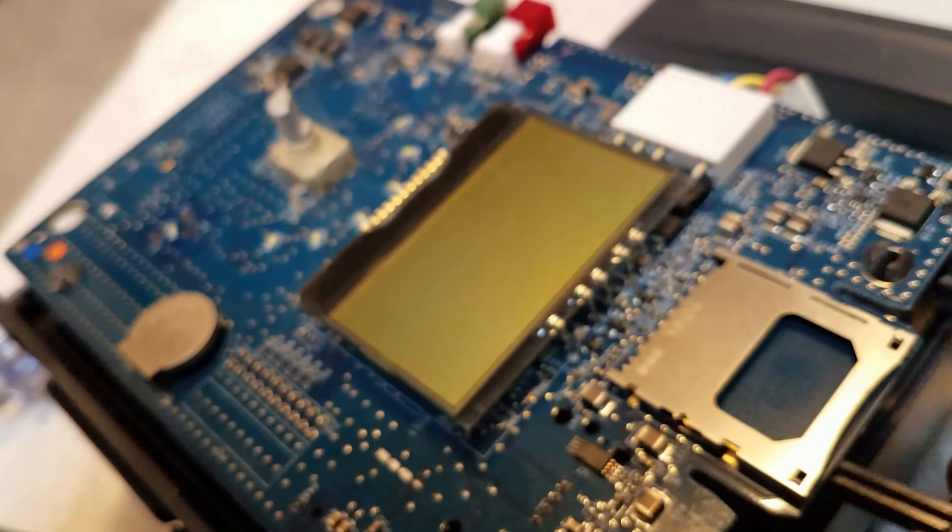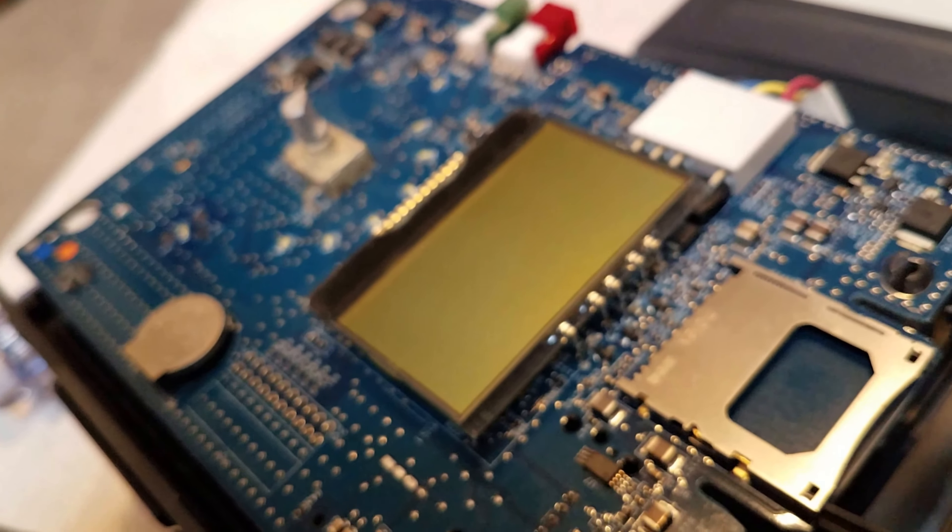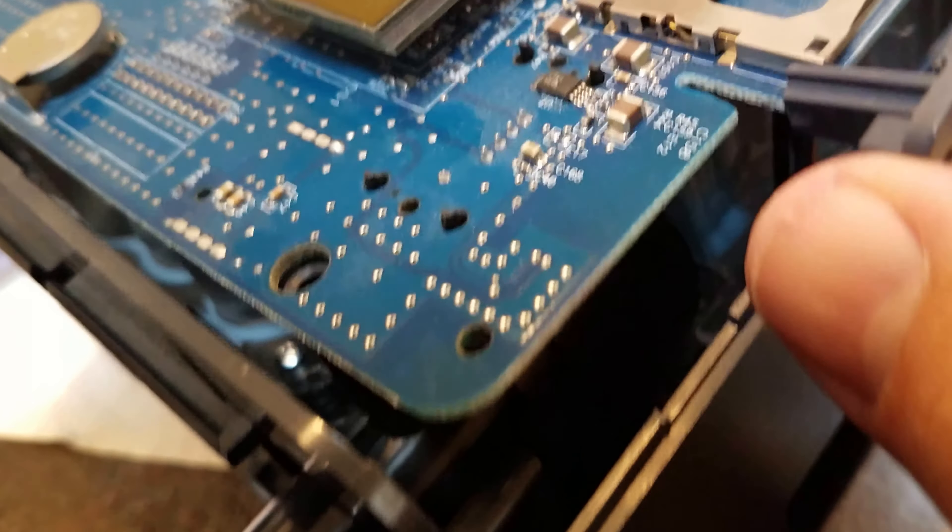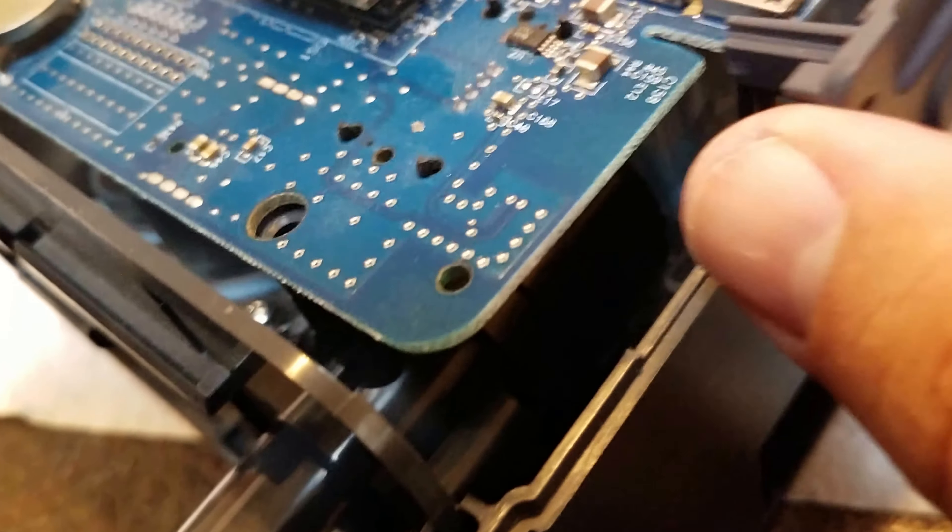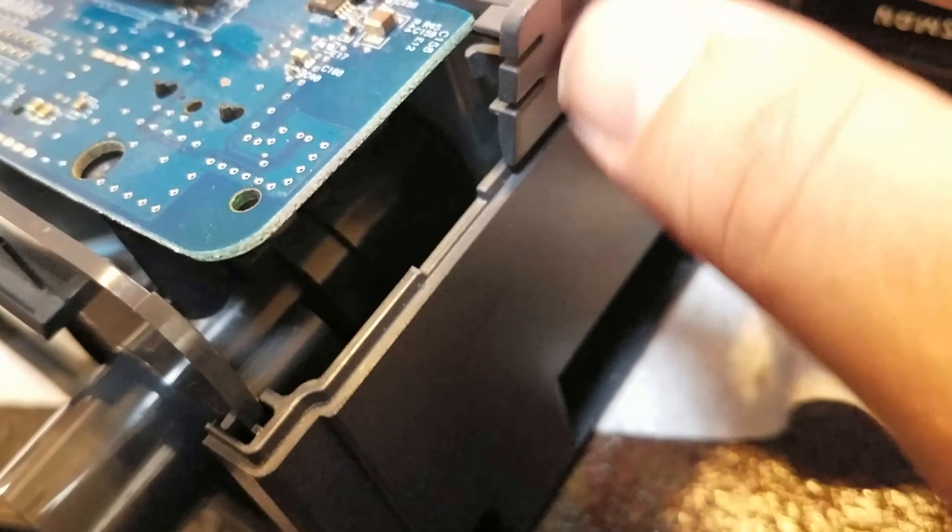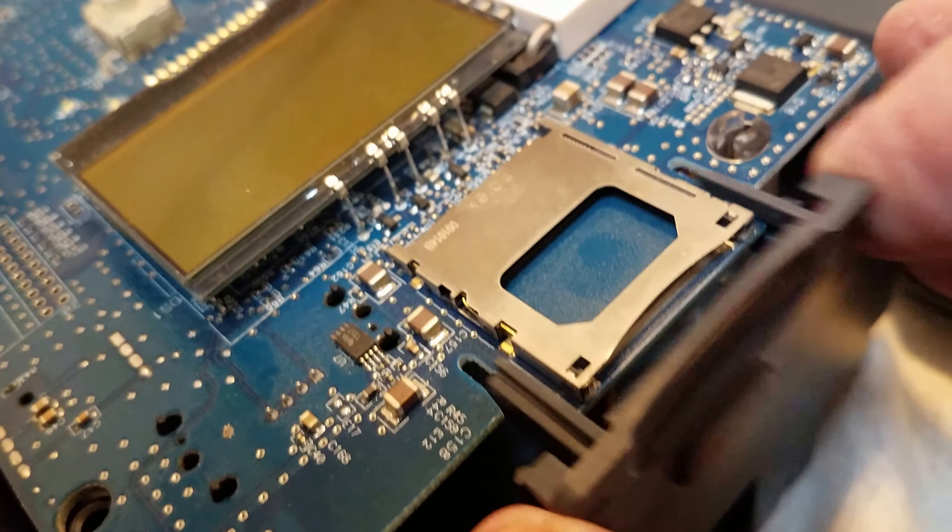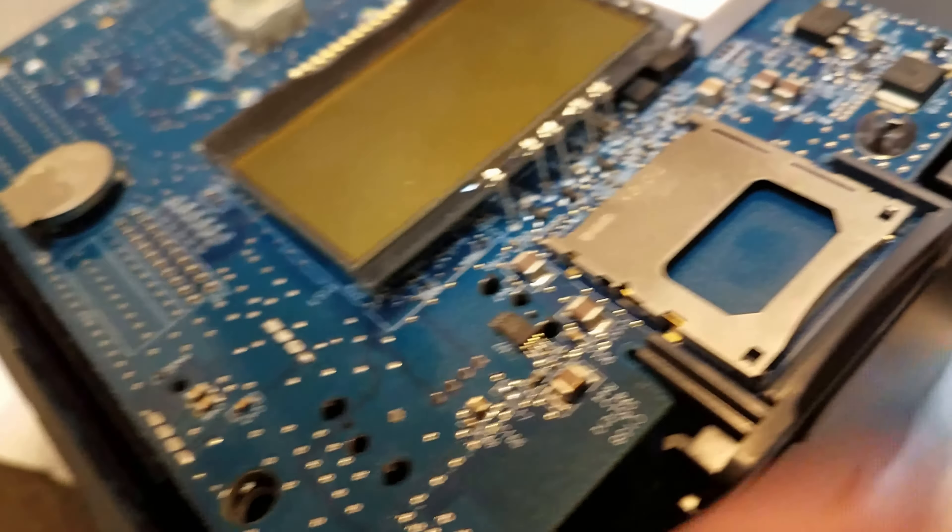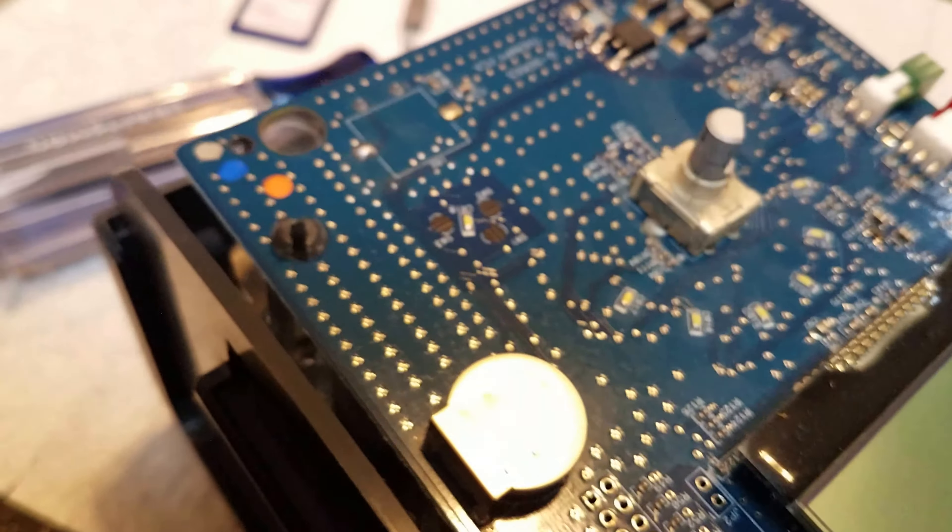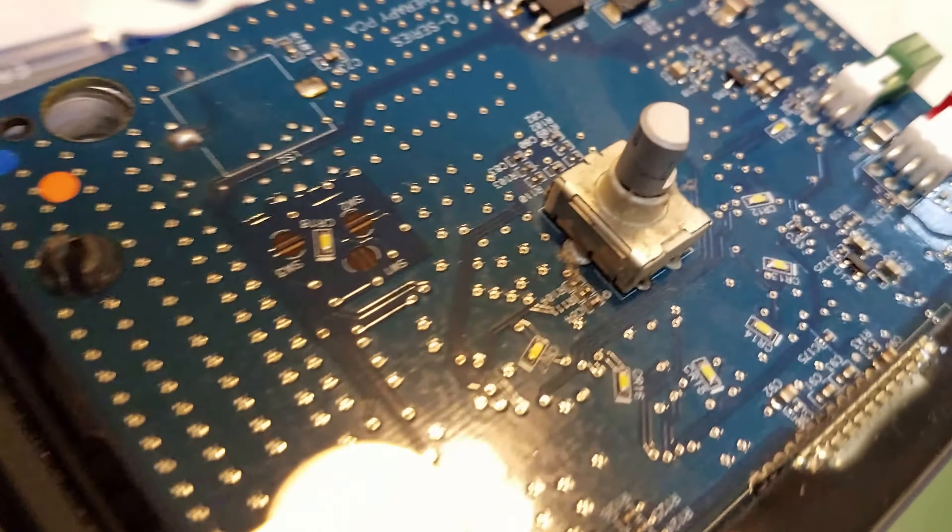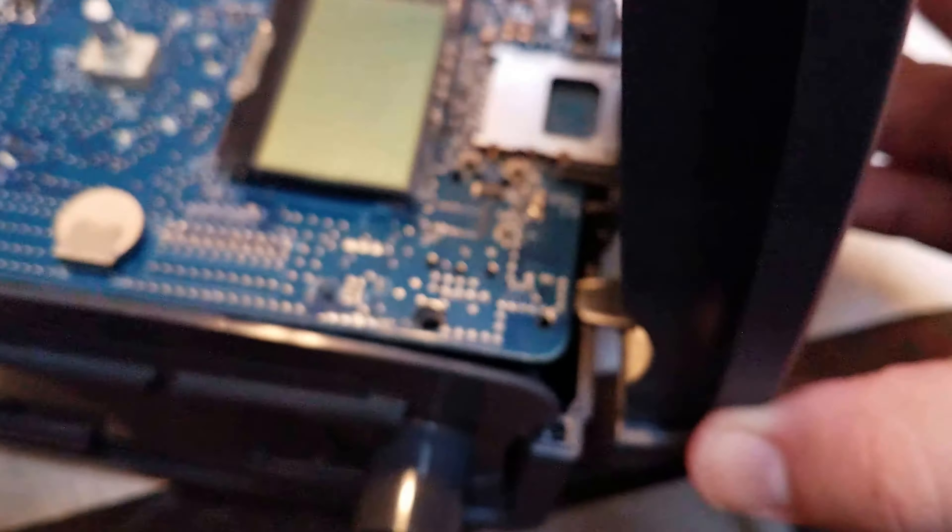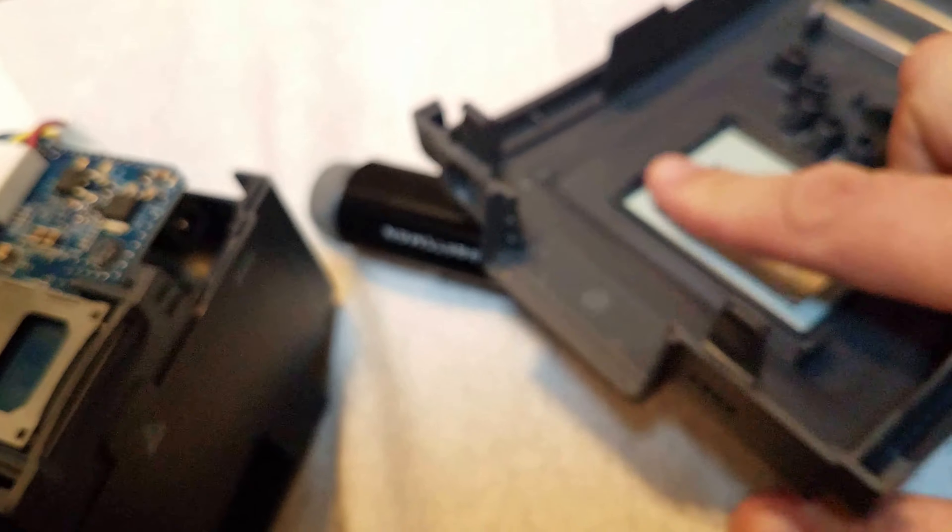From this point, if you remember, we had this little tray that I forgot to mention originally, and we can set that on here. It just pushes right on like that. And then this, these two tabs will sit in there. Let's see how close I get. Actually, I want to clean this lens. My lens is really dirty.